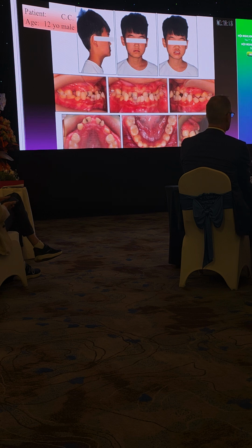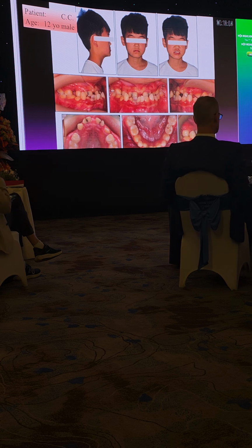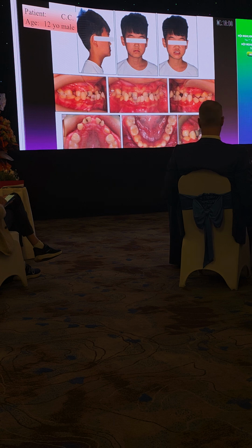All right, so one last question. What if your patient does not want to wear the face mask? See? You understand English, okay? What if the patient does not want to wear the face mask? And this little boy also has maxillary deficiency, right? Both the width and the anteroposterior. What would you do? Are you going to use clear aligners?